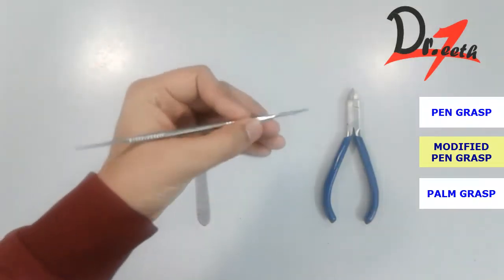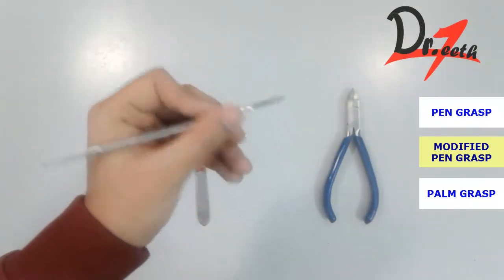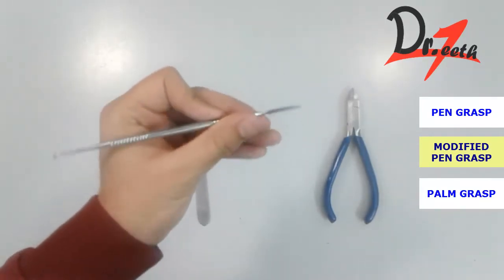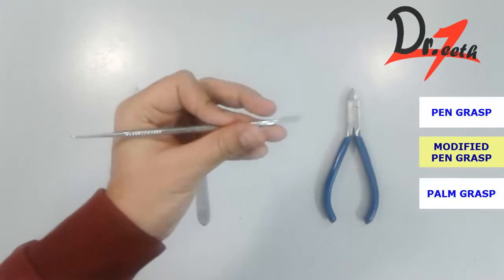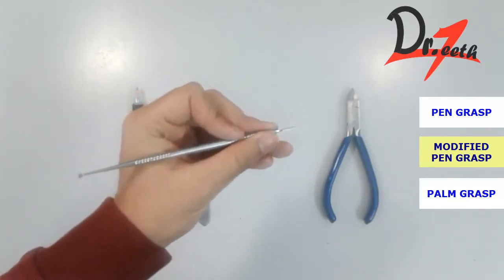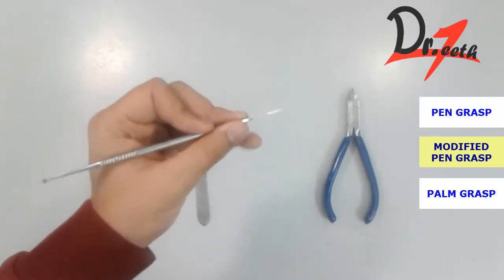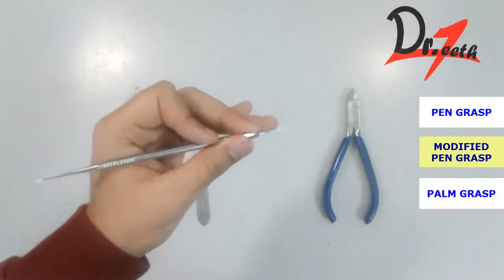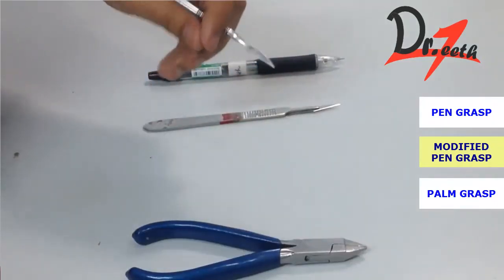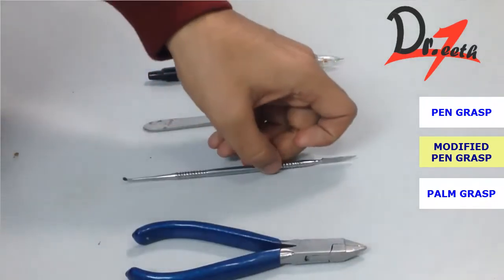This is the normal pen grasp, and when we move this index finger from here to over here, as you can see, it is called the modified pen grasp, for better control and stability.